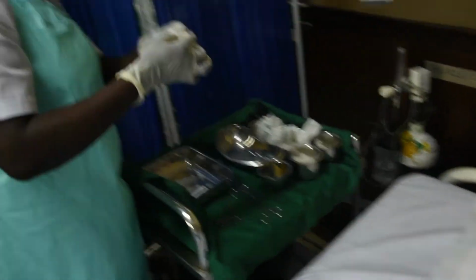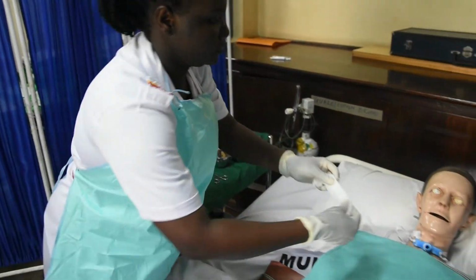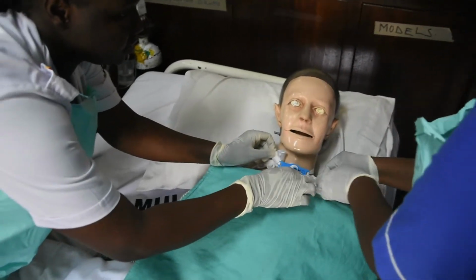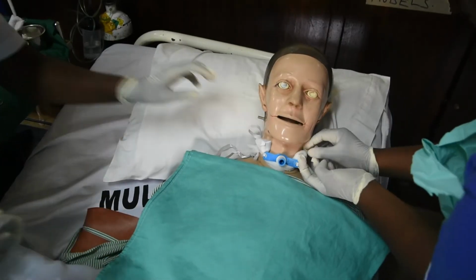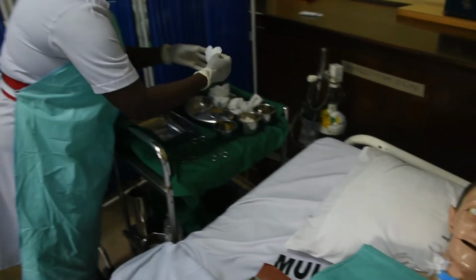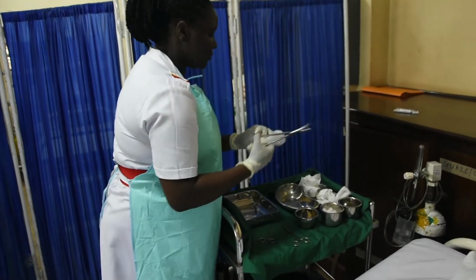So after that, we have to get a piece of gauze swab. And then lastly, we still get a piece of gauze swab. We cut a small layer.